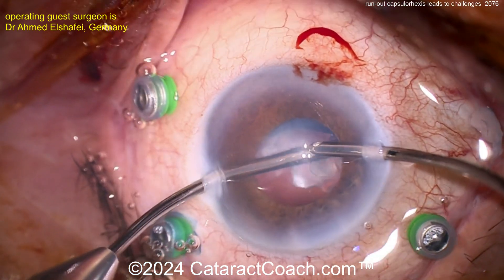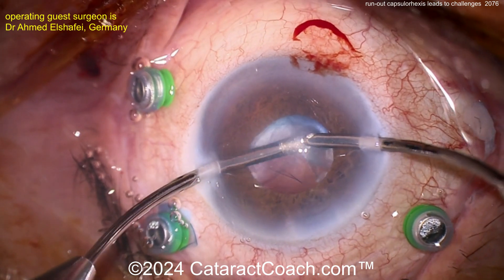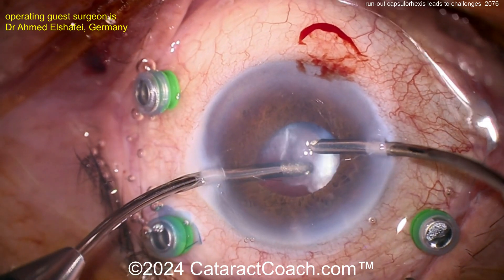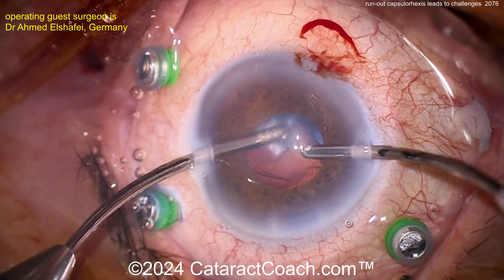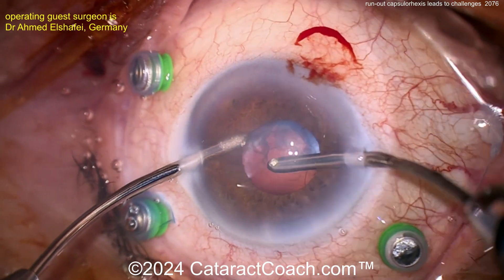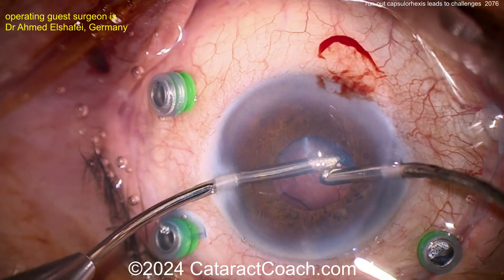Viscoelastic to help expand things — I like that. Now going underneath that piece; I like that technique to vacuum it up and get it up. I like how the surgeon here switched hands to get better access. Still got some lens material — you don't want to leave that behind, as it's going to cause a lot of inflammation.